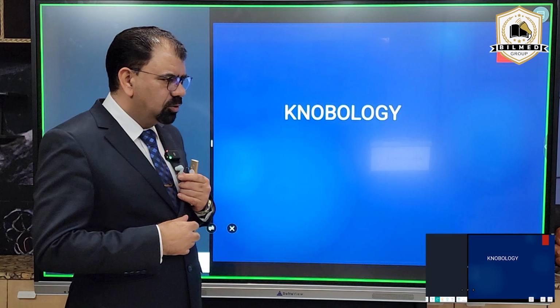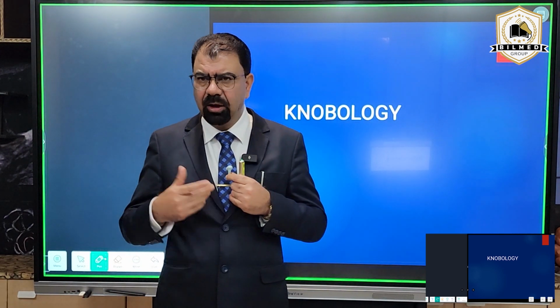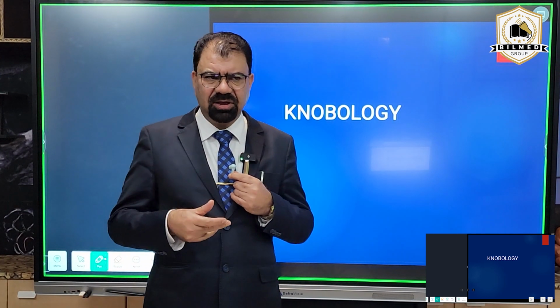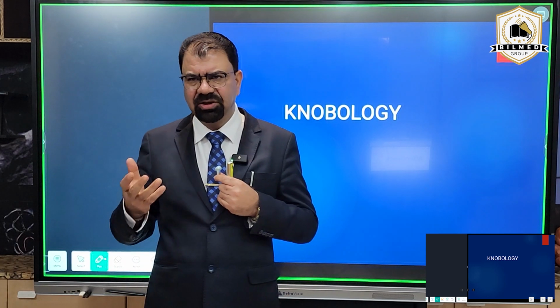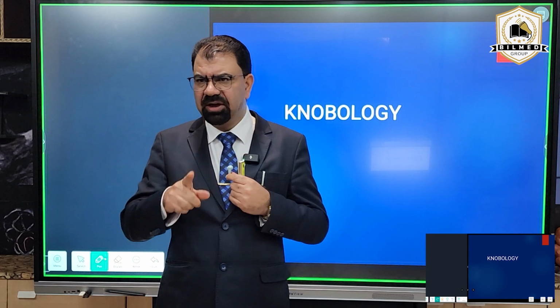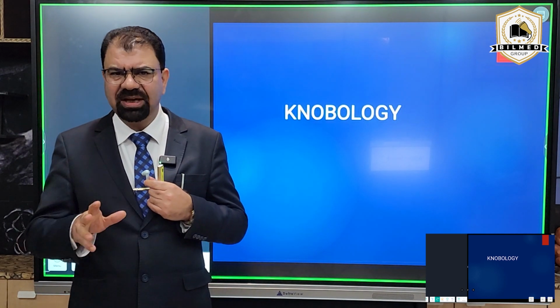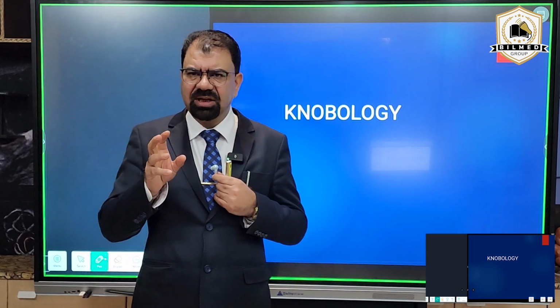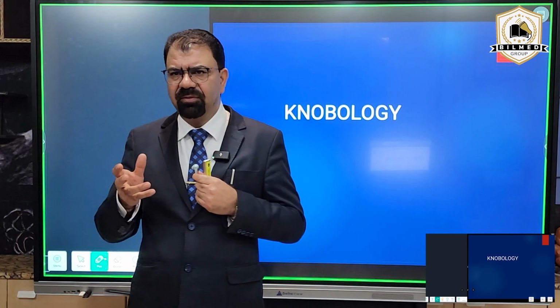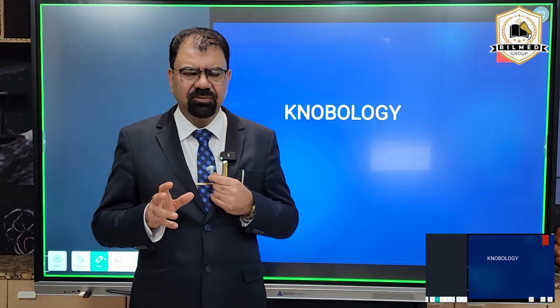So today we are, as already announced, taking a digital CME on Knobology, gynae ultrasound, and infertility folliculometry will be touched. Repeating for the last time, this is not a course. The detailed course of the gynae ops is of 3 months on server, on BGI server. So this is the CME only, where we will give you the introduction of the topics, and we will give you the highlights of what you have to see for.